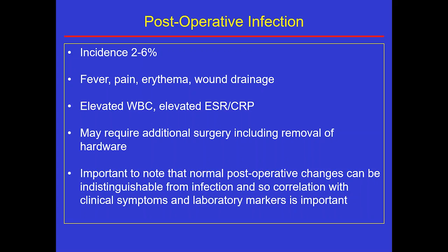You can get delayed infections 10 to 12 months out from your surgery, and these findings are thought to be related to hematogenous seeding or even a sterile inflammatory response to hardware if present, which allows a low virulence organism to start to fester. It's also important that in the early postoperative time point, enhancement of lumbar nerve roots can be seen in 20% of patients who don't have any symptoms, and can persist up to 6 months, with still 2% of patients showing lumbar nerve root enhancement.